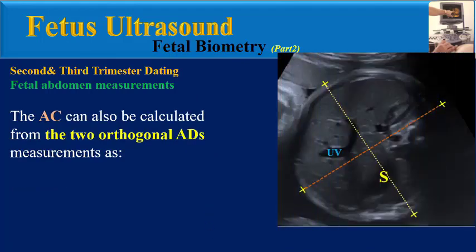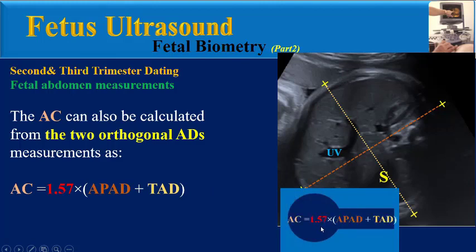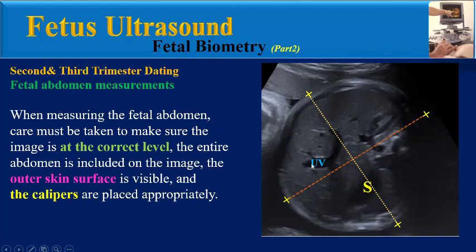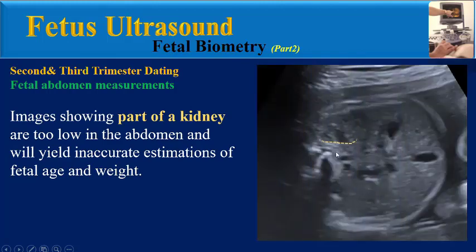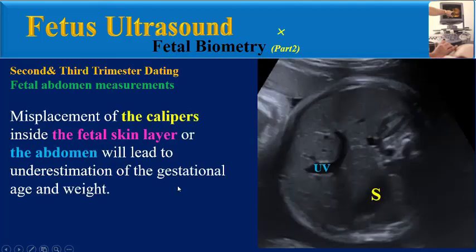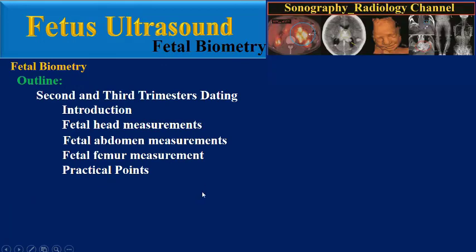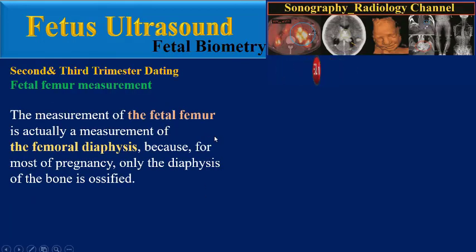The abdominal circumference is measured via elliptical calipers outlining the outer surface of the skin. The AC can also be calculated as: AC = 1.57 × (APAD + TAD). Care must be taken to ensure the image is at the correct level, the entire abdomen is included, the outer skin is visible, and calipers are placed appropriately. Images showing part of a kidney are too low and will yield inaccurate estimations. Misplacement of calipers inside the skin will lead to underestimation of gestational age and weight.